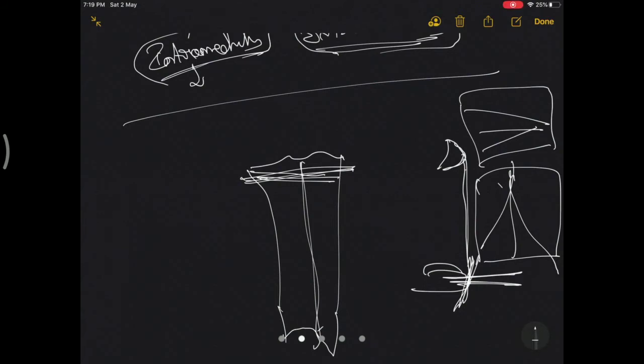So we will stick to mechanical alignment TKRs. You will take a perpendicular cut, and the slope is adjusted according to the implant instructions, because many of the implants have their inbuilt slopes. So you'll have to consider that.